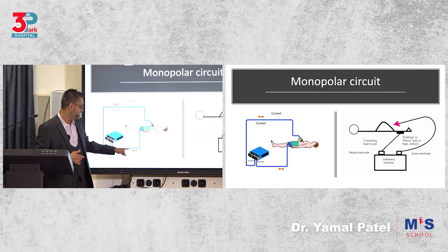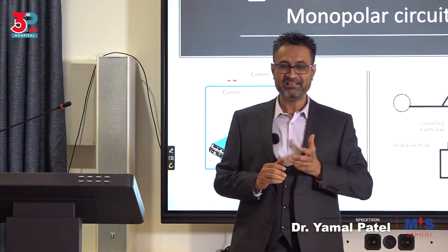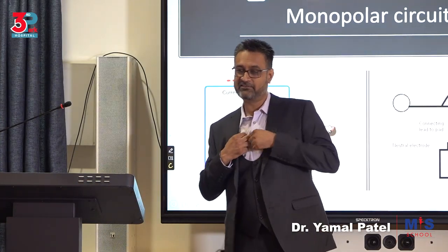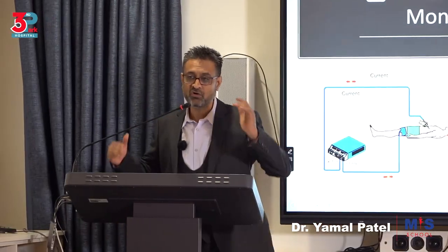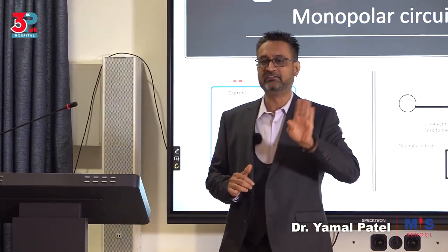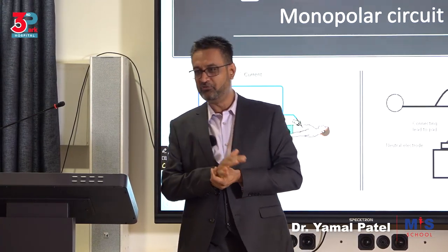In the newer machines, if this plate peels off a little bit, it will break the circuit and the machine goes off. But in the past, it was not doing that. It was not looking for stray current exits. So you'd get an exit through an ECG electrode or through an earring, and you'd get burns. So unless you know energy, don't use it. This is one of the most dangerous pieces of equipment to play with in an abdomen if you don't know how to use it.